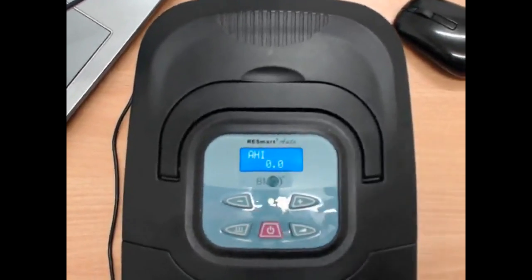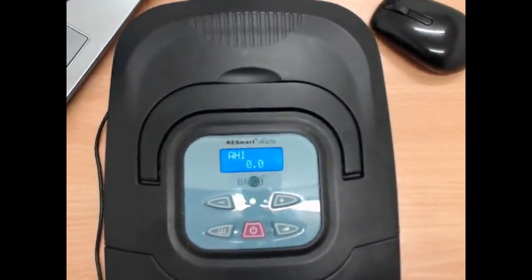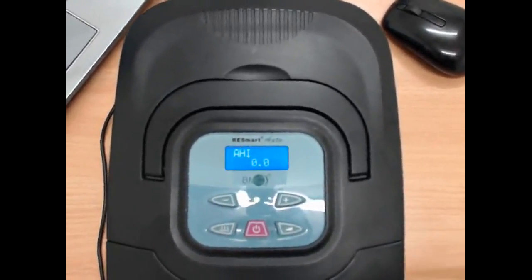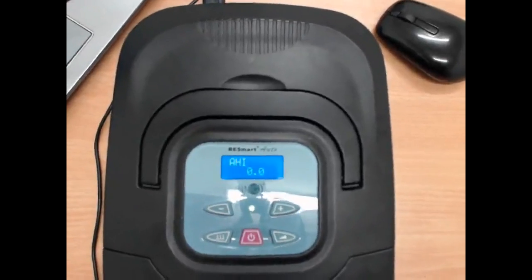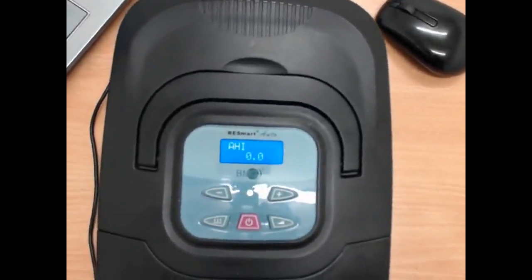So hypopnea and apnea are all part of the apnea-hypopnea index. And it gives us an idea per hour as to how many times those events are happening. And we want it to be less than 5. That's the goal. Right, everything's relative.